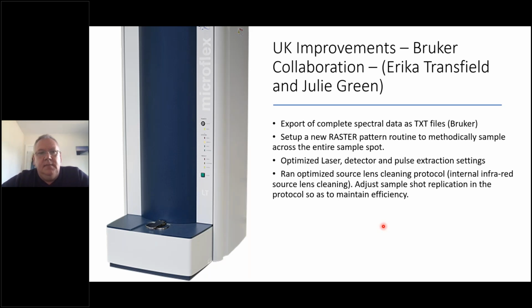We also looked at how this would perform on the Bruker Biotyper, which is very widely used across the world. And this is great collaborative work from Erica and Julie in the UK. They helped us with how we could get the data off and analyze it as text files. We set up a different raster pattern because we don't sample a small number of spectra. We actually have many thousands of spectra accumulated per sample, and we have a specific, well-defined raster pattern as we go across the spots. So we're able to put that onto the machine.